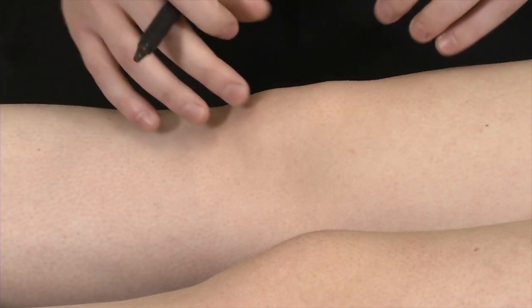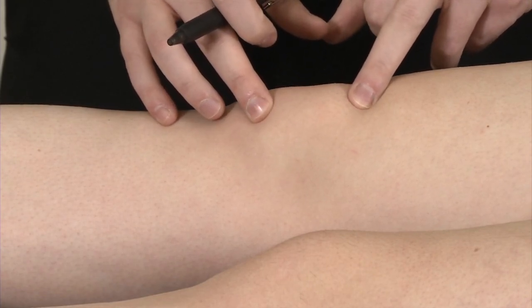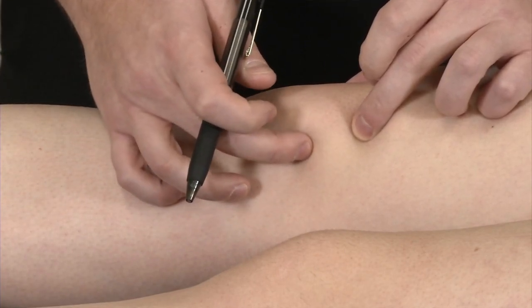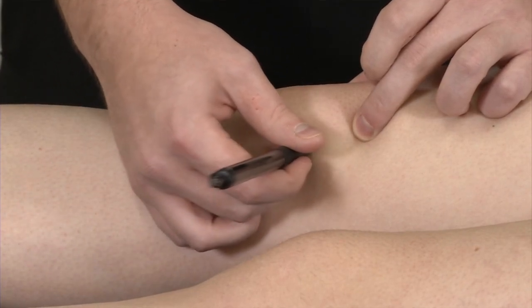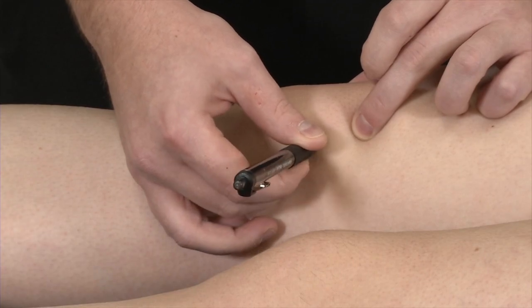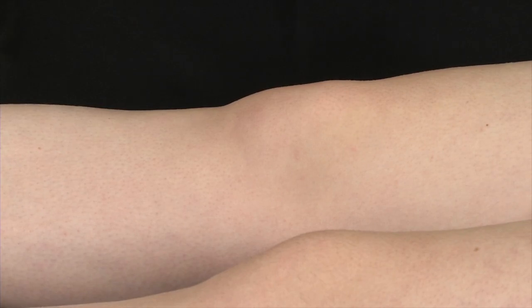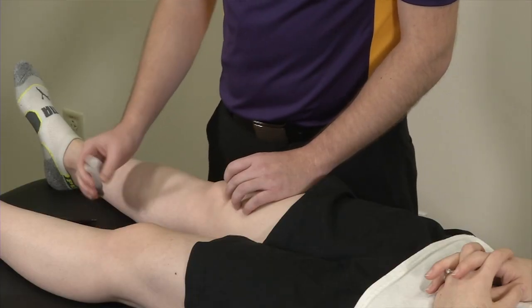For the approach to get into the medial aspect of the knee using the medial retropatellar, as you define the superior and inferior poles of the kneecap, you put a little bit of traction onto the skin, define the mid part of the medial patella, and then define that medial sulcus. In that mid portion is where you're going to mark your skin. I'm just using a pen without the point out. We try not to use ink because you can tattoo the skin as you pass your needle tip through that. As I have my point there, I would go through and sterilize the skin. We put a little bit of traction on it first because then as we retract the skin, that point moves up to exactly where I want to go.